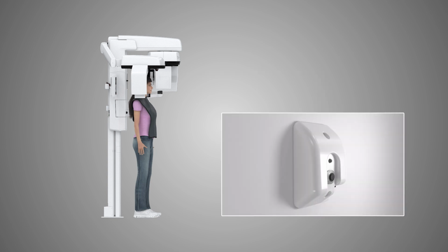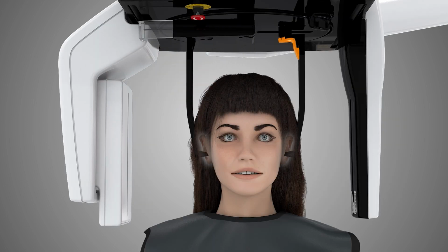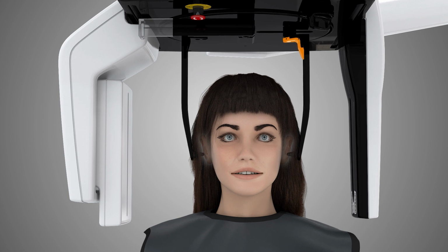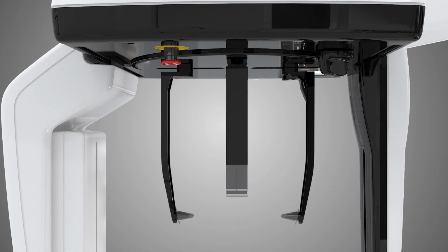Press and hold down the exposure button. During the exposure, an audible signal will sound and the exposure warning symbol illuminates. Once the X-ray has been captured, the audible signal will stop. Release the button once this has occurred. Pivot the nasion support into its uppermost horizontal position. Press the ear rod brake button, slide the ear rods away from the patient, and guide the patient out of the unit. Remove the disposable ear rod covers and disinfect the unit according to the directions in the user manual.